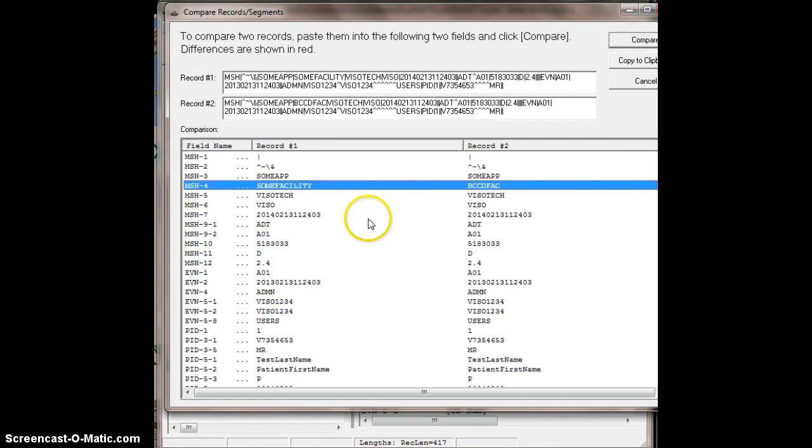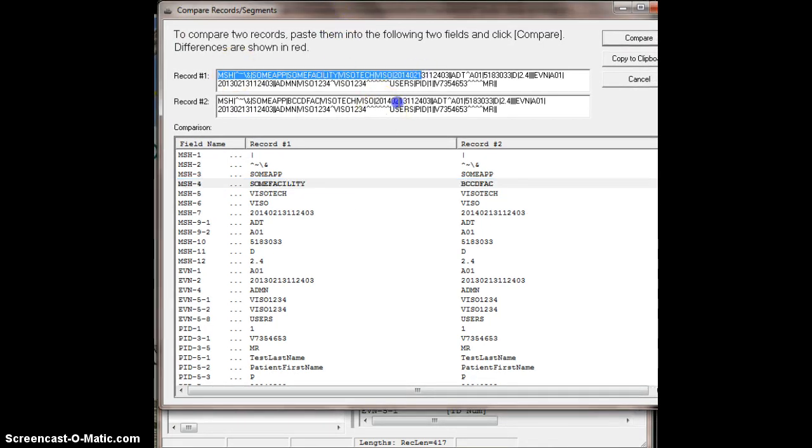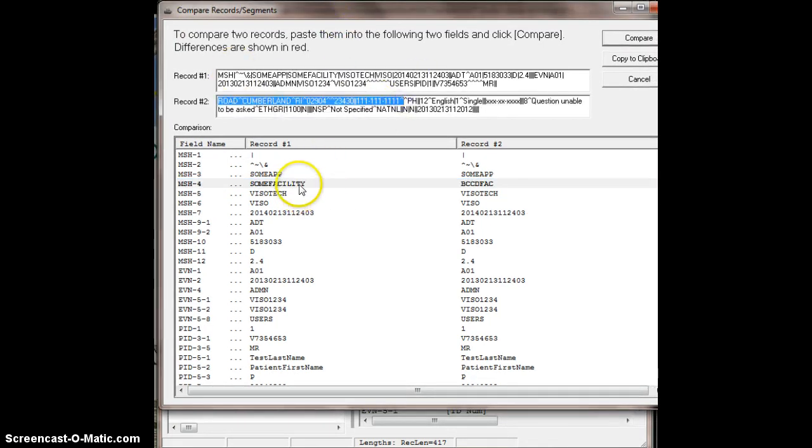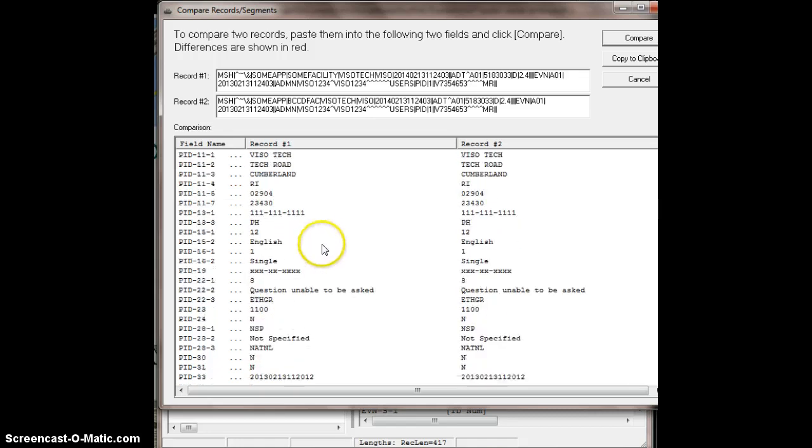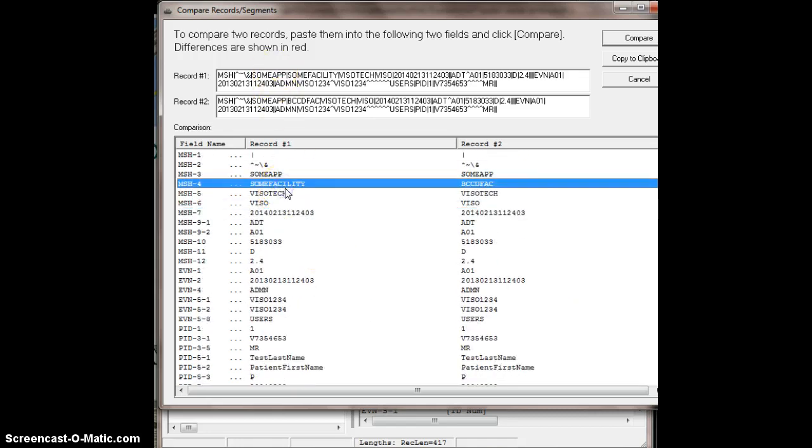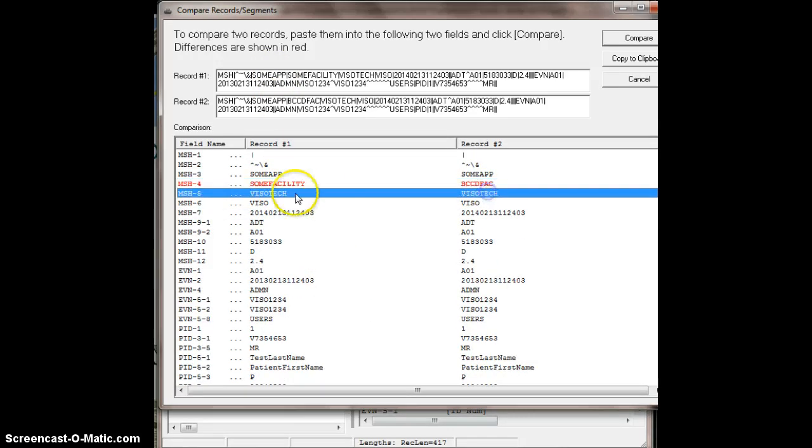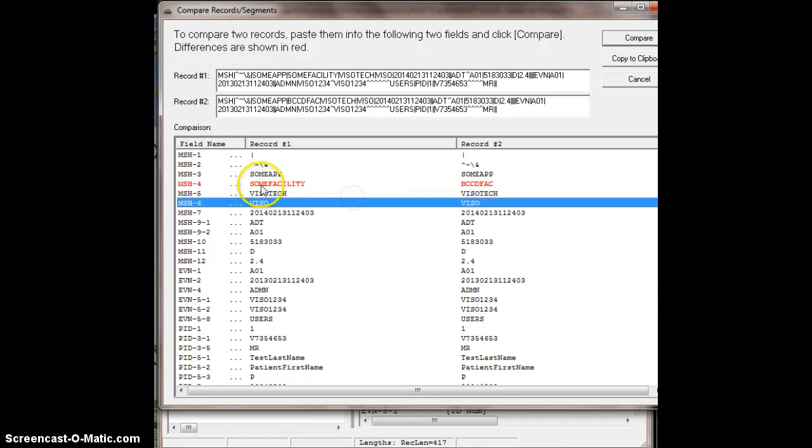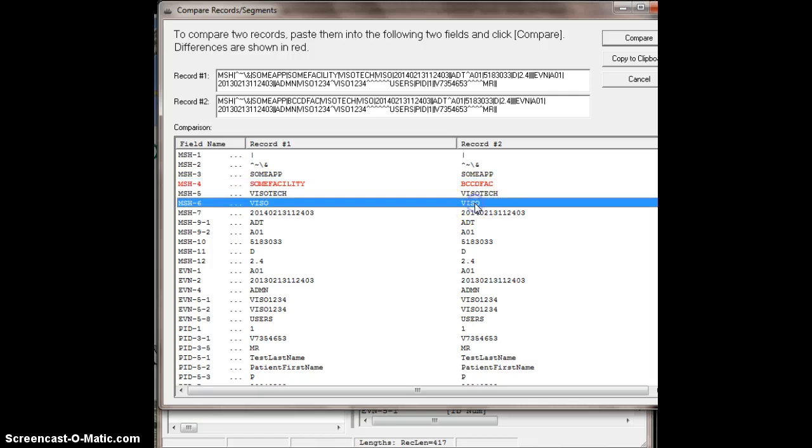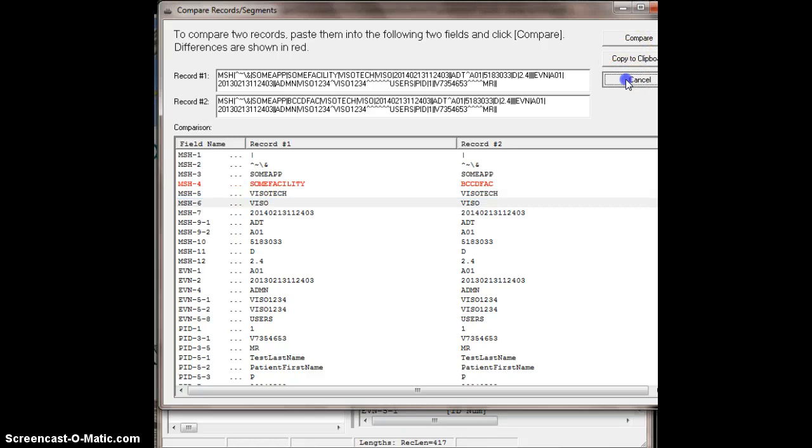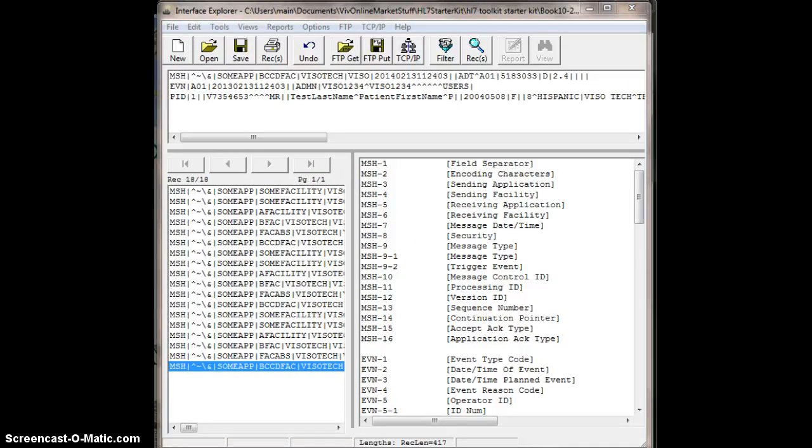And there we go. What are the differences? You can see the record number one, record number two, differences in red. So if I scroll down my list, the only difference between these two HL7 messages are MSH4. This one has some facility value, this one has VCCD facility value, so that's cool. You can also copy through the clipboard and all that cool stuff. So you can do that with two files, it looks like.